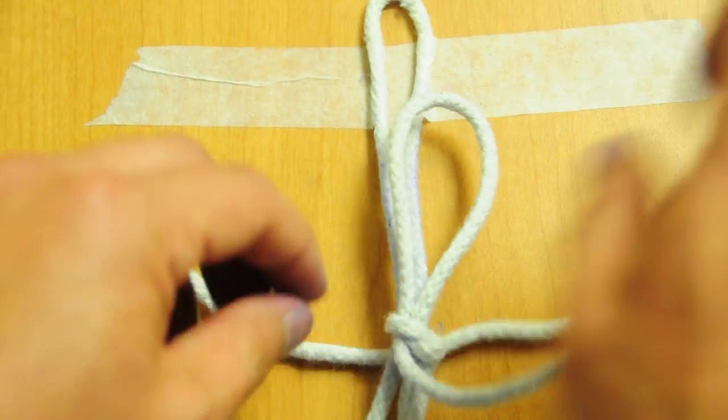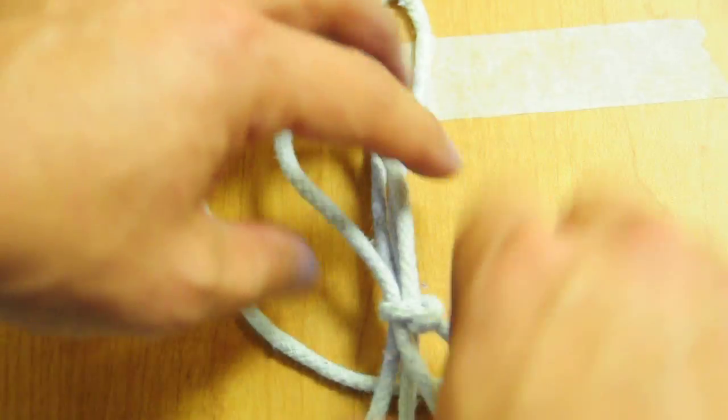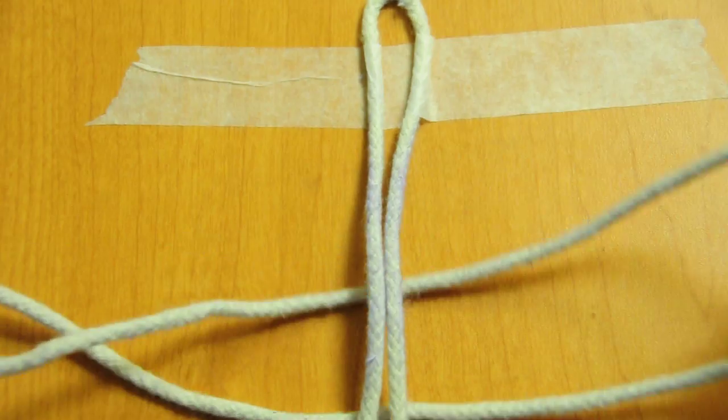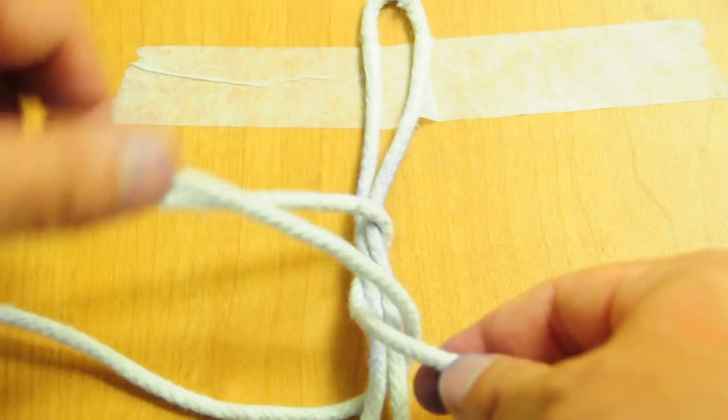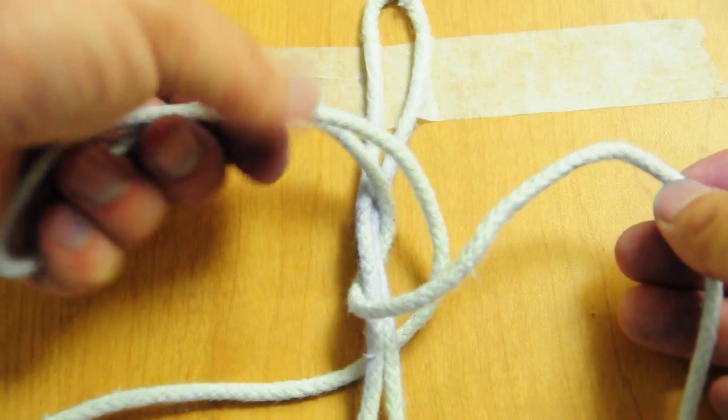So when you can, try to remember to tie with the free end. Number one, try to avoid surgeon's knots with a loop. Number two, always tie with the free end, which is this one. Keep the loop here.